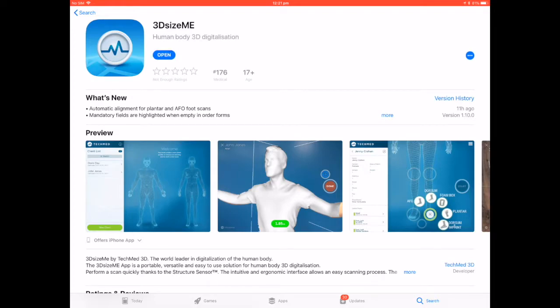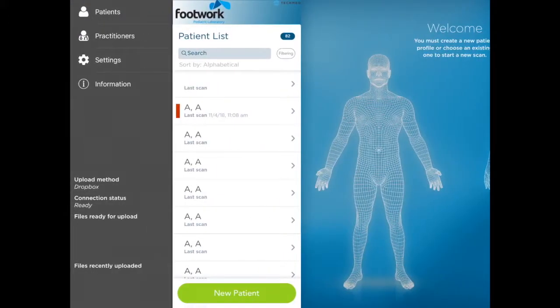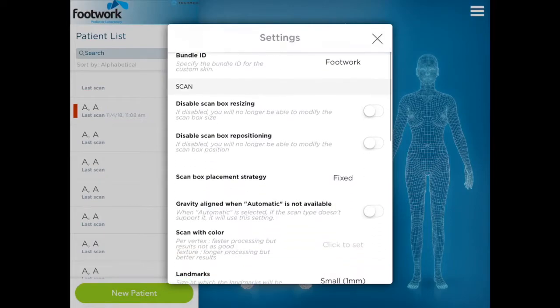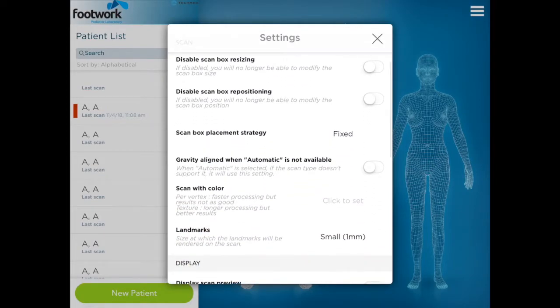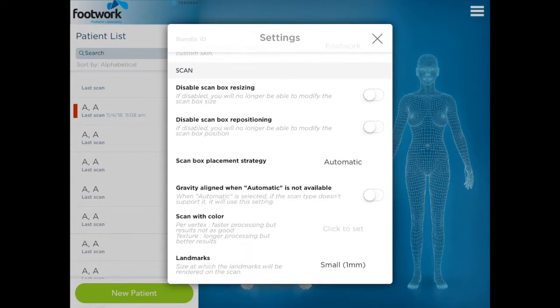Open the app. Once the app is open, you'll notice all of your existing patient data has carried across. Go to Settings — you need to change one setting, and that's the scan box placement strategy. Change this from Fixed to Automatic.